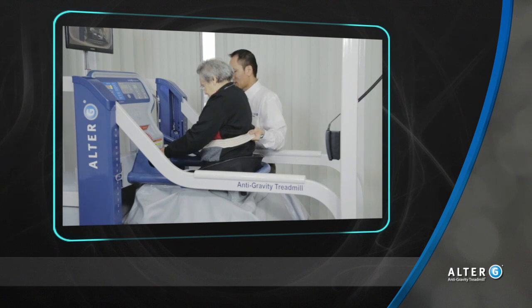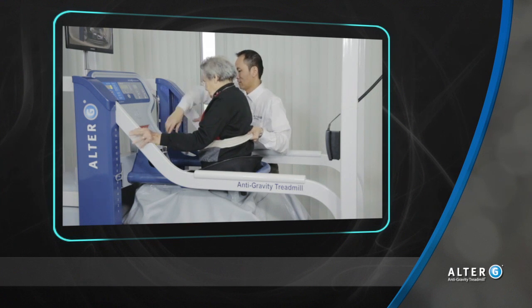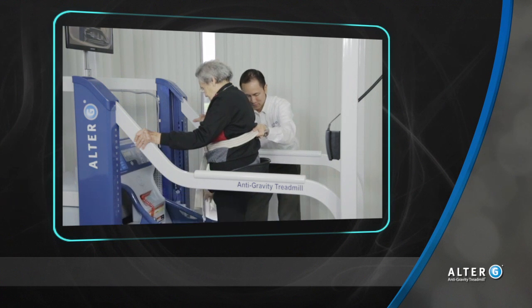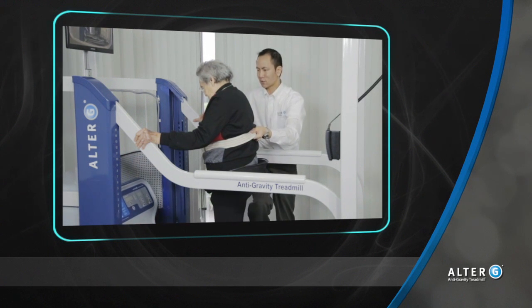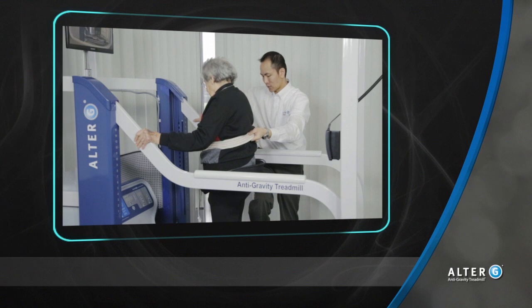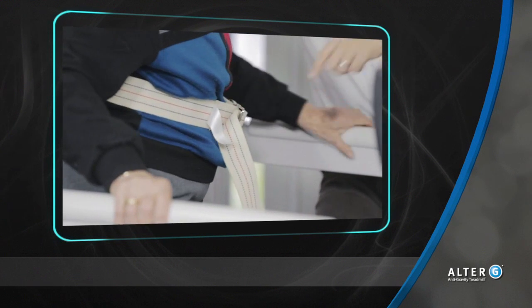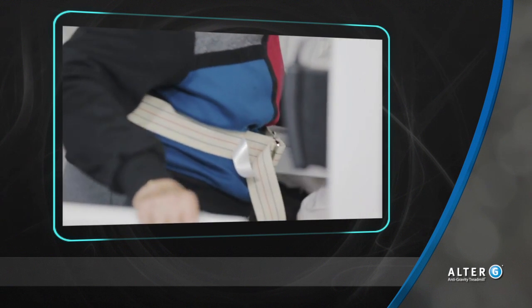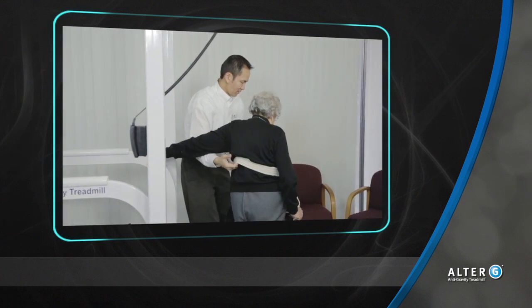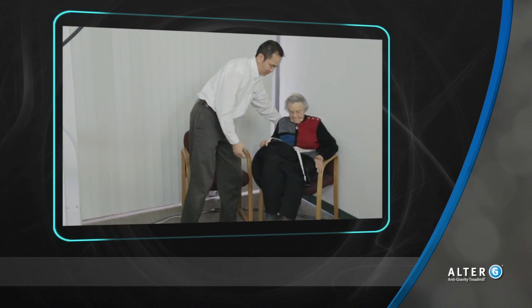At the end of the treatment session, hold onto the gait belt again to help guide the user off of the Alter-G. Since the patient may be fatigued after their session, they may require extra assistance to exit. If the patient is unable to remain standing, the therapist can slowly lower the patient to the treadmill with the gait belt and ask for additional assistance if necessary. It is recommended that the patient not be brought to the point of fatigue in the Alter-G. For carryover to overground walking, it is always suggested that patients ambulate overground for a short period at the end of each Alter-G session.